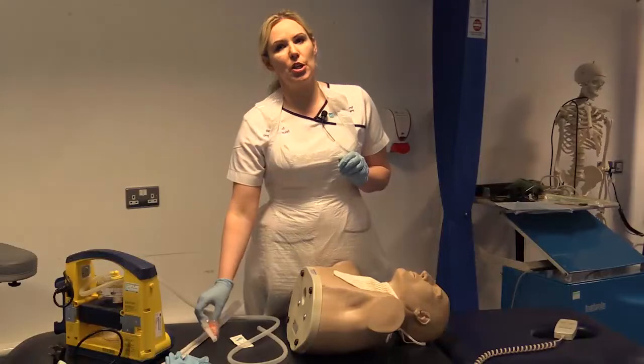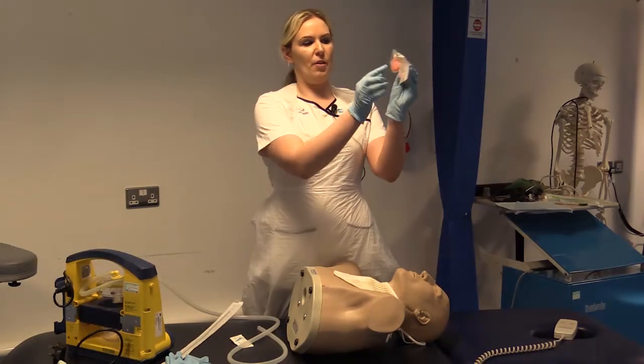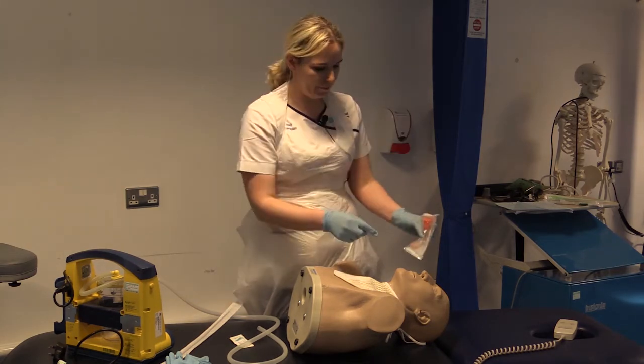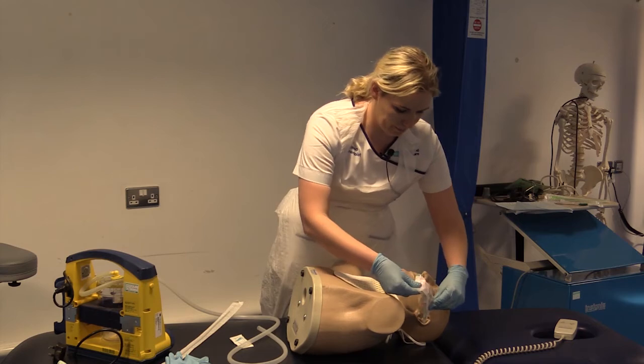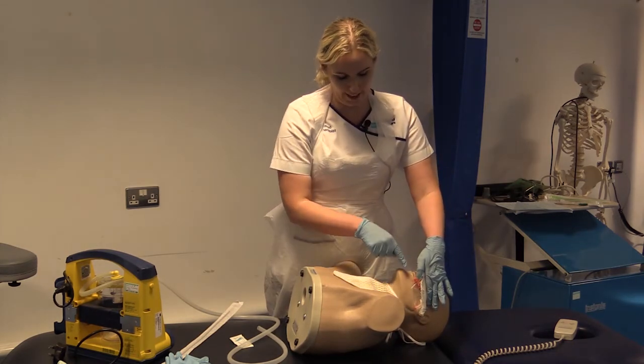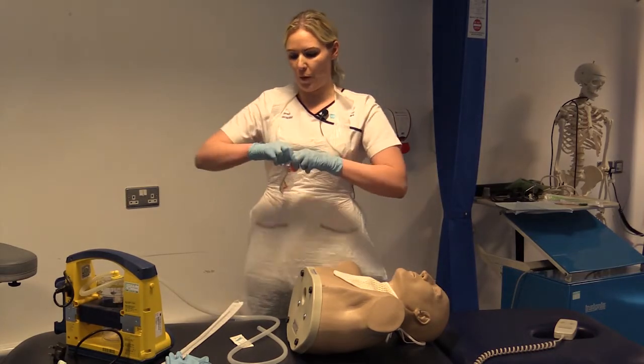So the first thing we're going to do is choose an appropriate sized airway. So to do that, you measure from the tip to the end of the airway, and we go from the mandible to the lip. Okay. And the end of the airway should be in line with the lip. Okay. So again, we're going to insert our airway. So we just open our packet.